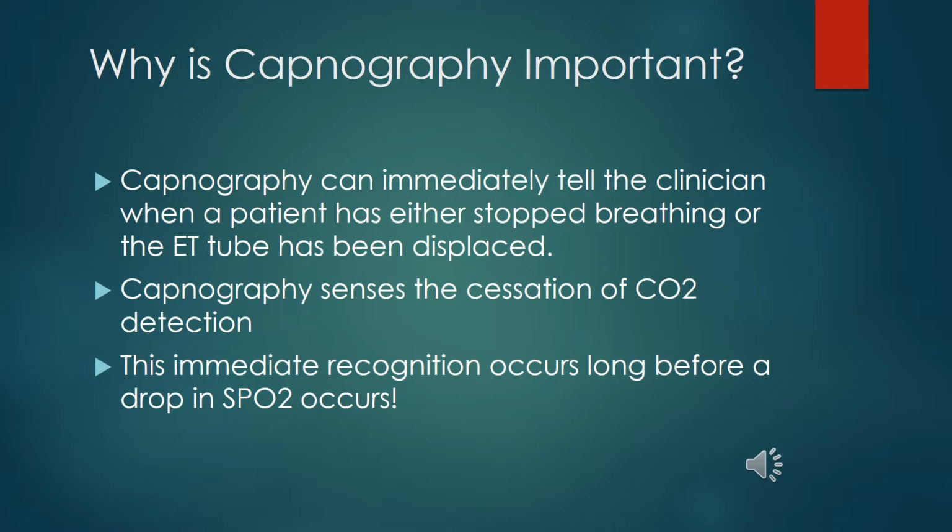They usually have both on a capnography monitor, where it'll give you the breath rate and the CO2 reading. So as soon as you see those go blank, you can rest assured the patient either stopped breathing, or if they're an intubated patient, for some reason it's not sensing CO2, so the patient's tube could have become dislodged or entered the esophagus. If it was rattled up and down, it could have come out of the trachea and gone into the esophagus. Therefore, the patient can't breathe.